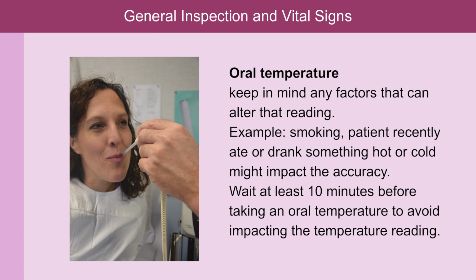So when you're checking oral temperature, I need you to keep in mind any factors that can alter that reading. For example, smoking, patient recently ate or drank something hot or cold. These things will impact accuracy of measurement. So wait at least 10 minutes before taking an oral temperature to avoid impacting the temperature reading.